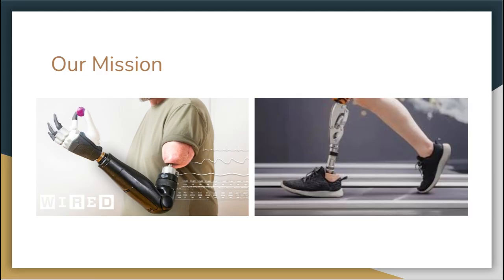And the biomechanics are just as impressive. Biomedical engineers strive to create a link between human and machine. They combine design, material science, and medical knowledge to improve the day-to-day lives of its users. This includes the addition of actuation systems like motors and pneumatics that allow movement that mimics natural limbs. Fabrication techniques, including 3D printing, are making custom prosthetics more accessible than ever.